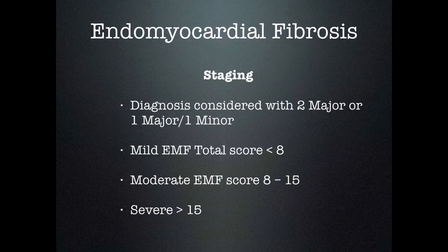So staging is based on ultrasound findings. With staging, we look for the diagnosis with either two major or one major and one minor criteria. Then you can calculate a score to help you know whether it's mild EMF with a score of less than 8, moderate EMF with a score of 8 to 15, or severe EMF with a score greater than 15.